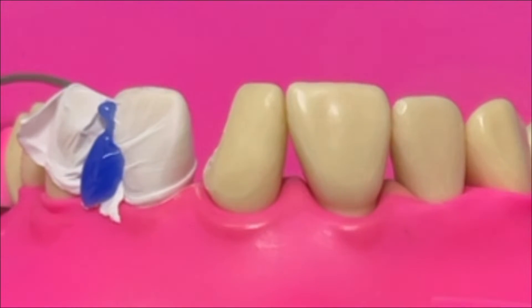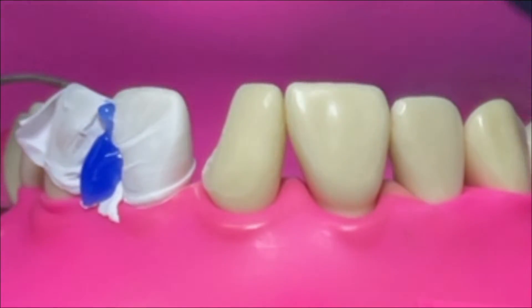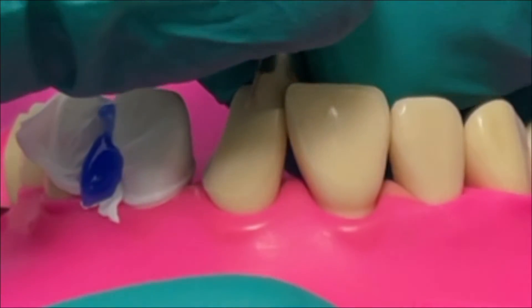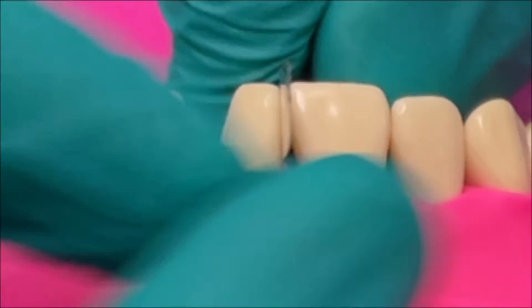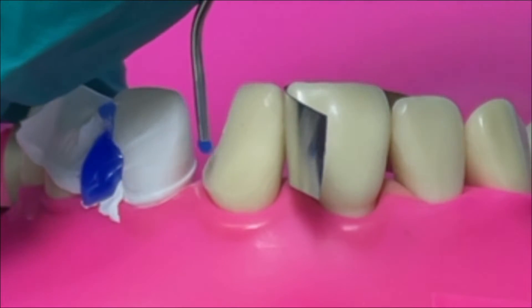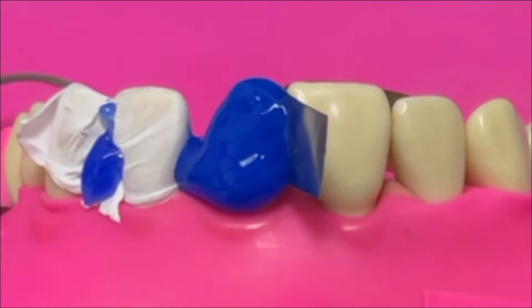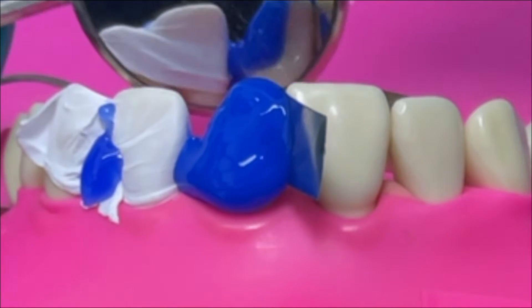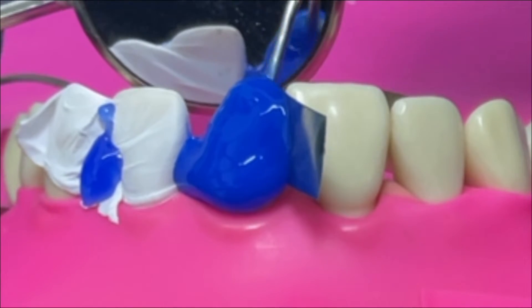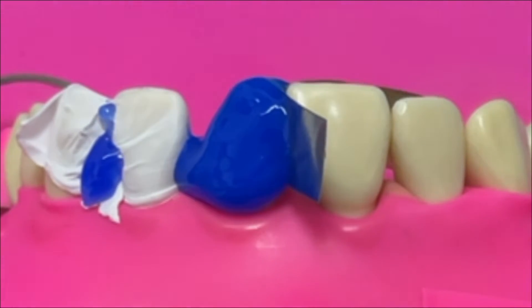Once you've got the PTFE in place, add a little bit of liquid dam and cure that - it's going to stop it flopping all over the place when you come to do your etching. On the mesial side where we've got an intact contact point, I prefer to use a little bit of metal strip roll - it's very cheap, very easy to place, and secures itself. For my bonding strategy, because we've got a lot of enamel here, I'm definitely going to use a total etch technique. I tend to cover everywhere with phosphoric acid since it's difficult to only etch the enamel, and leave it for at least 15 seconds.